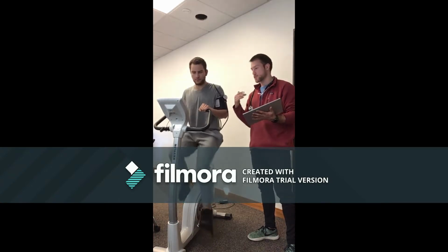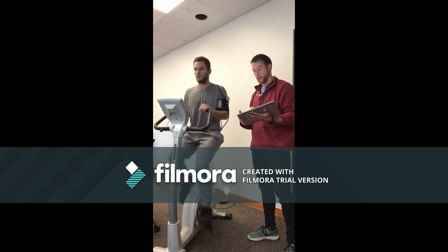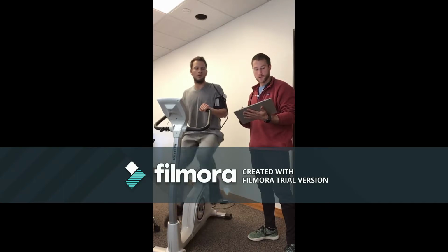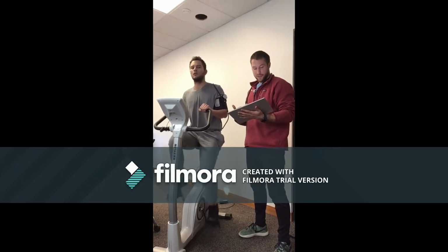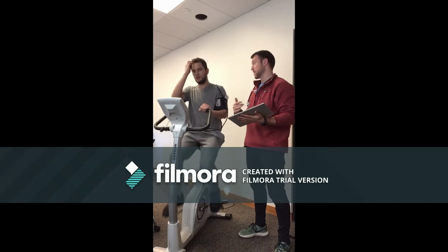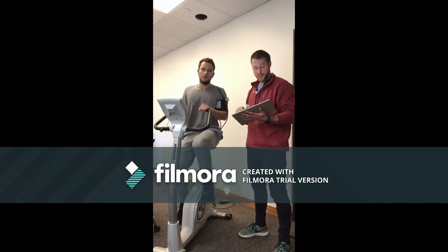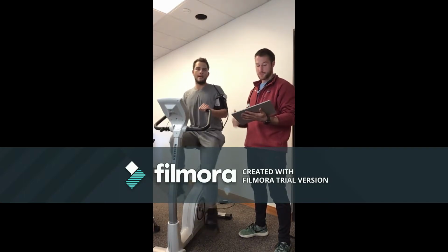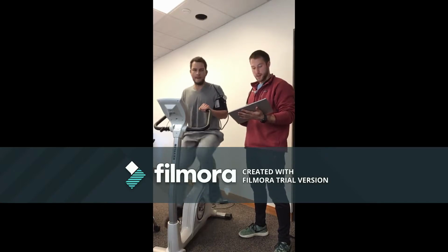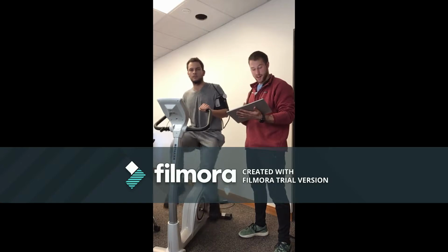We just want to make sure that your heart rate and your blood pressure are going according to the workload you've been doing. So we would want to stop the exercise if you had a decrease in your heart rate despite the fact that we've been increasing the workload or keeping it constant. If your systolic blood pressure ever gets above 220, we'll also stop. Same thing goes if it decreases more than 10 with activity. So far we haven't seen that either.